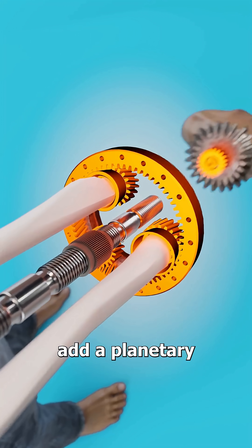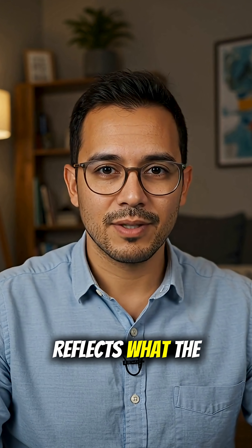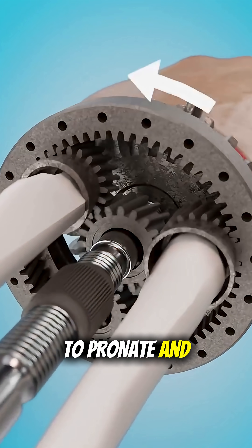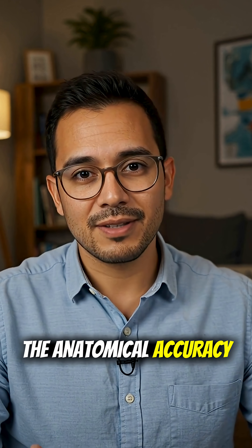Inside your forearm, add a planetary gear set that twists it left and right. This part is actually fascinating, because the animation reflects what the real bones do. The radius rotates over the ulna, allowing the forearm to pronate and supinate. Most people don't know this, so credit to the creator for the anatomical accuracy here.